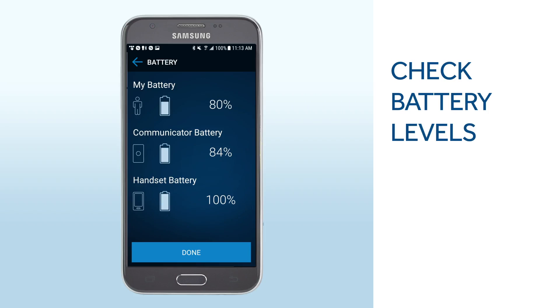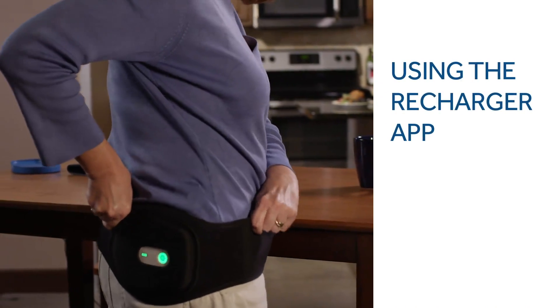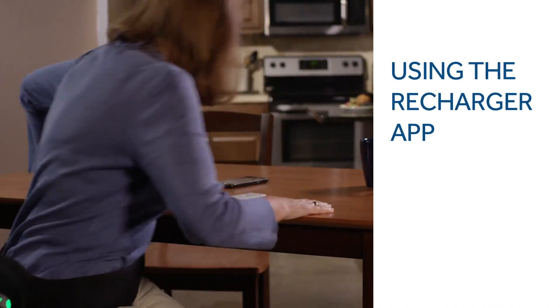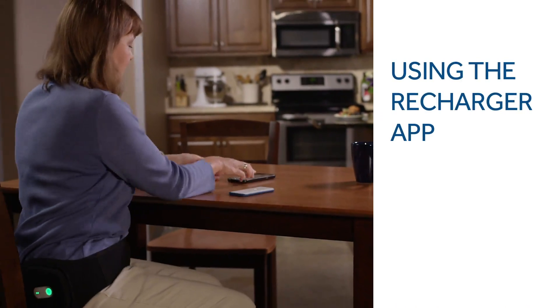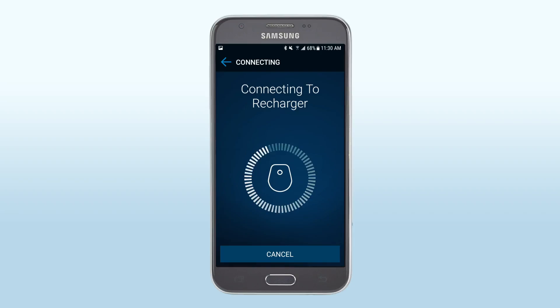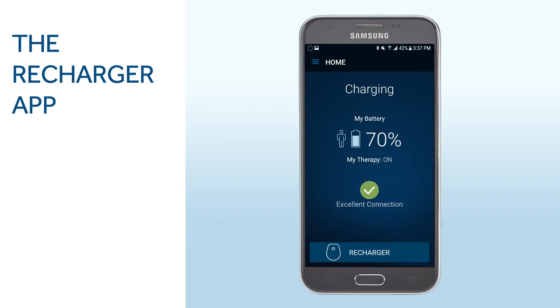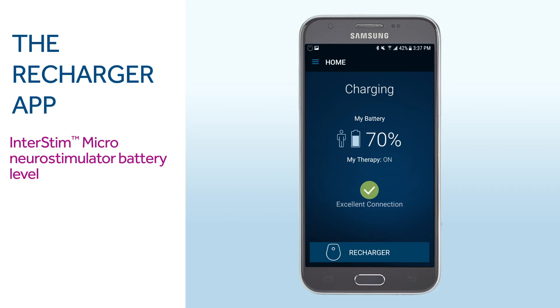This concludes your MicroMyTherapy app instructions. Next, we will cover the features of the Recharger app. Once you have begun a charging session, select the Recharger app on the home screen. Your smart programmer will connect to your recharger and then to your device. Once connected, the Recharger app provides the battery level of your Interstim Micro Neurostimulator and your recharger. It also shows your connection strength.